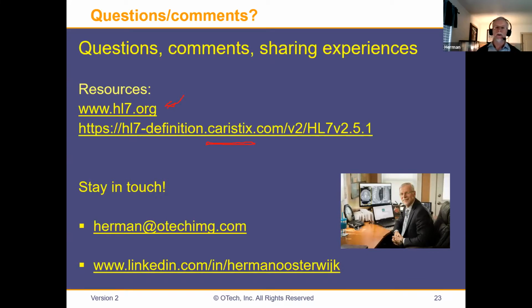What you can do, you have an HL7 order. You can drag it over into that window, and then it will be added to the database. Then you can do an internal query in Conquest. You can do a modality worklist query internally to make sure it works. And then externally, you can actually query that provider too. So that's the one that I use the most because it's so easy to use. You can drag orders in there.